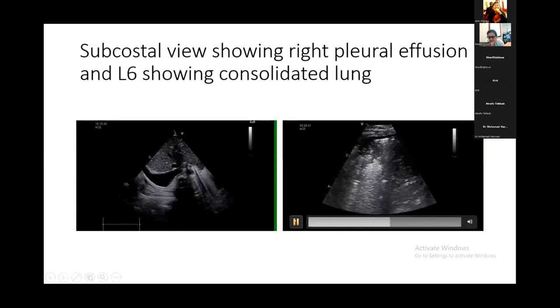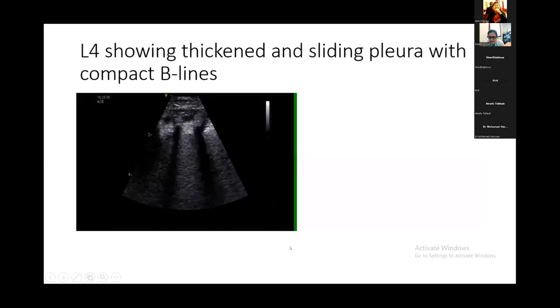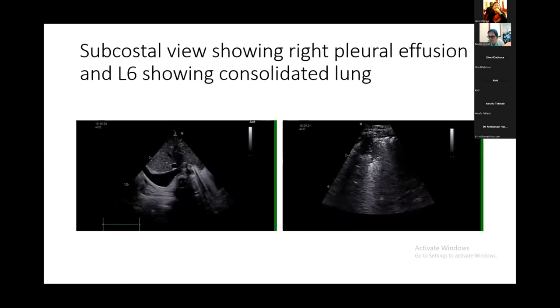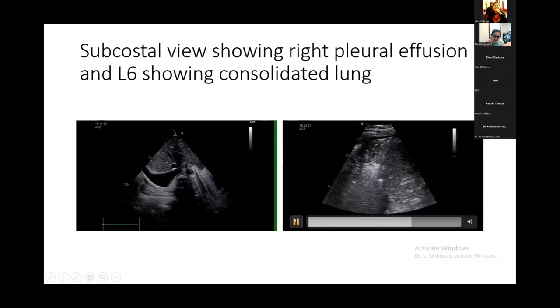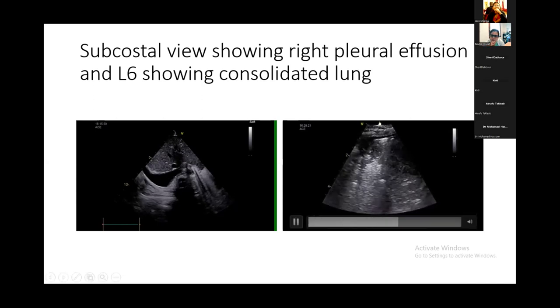And there is some shred sign though, Dr. Atnafu. When you see it goes down there on the left side of the screen when the clip moves, there is some degree of shred sign that we don't see all the time. And this was done with a phased array probe, I suppose, which is why we're seeing this clip a bit differently. But it would be interesting to see how that follows up. It's interesting how the CRP levels were not at all raised. You mean this area?